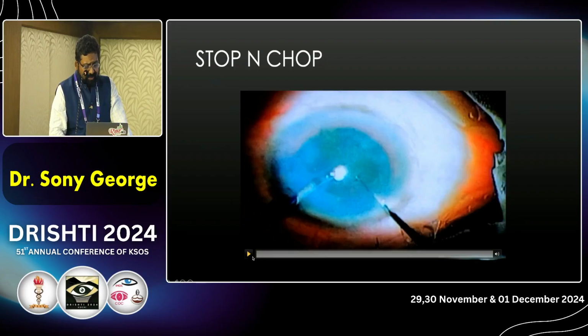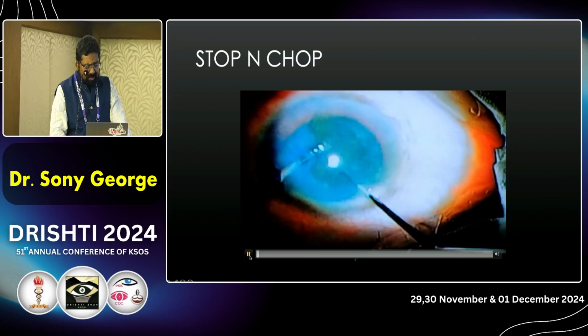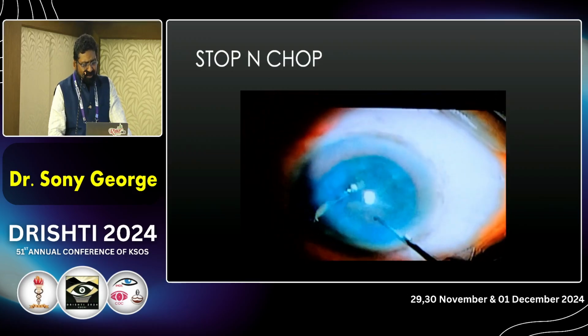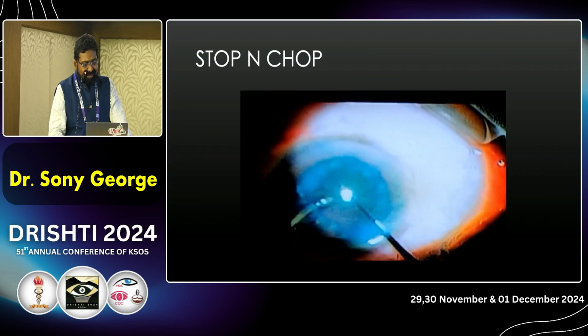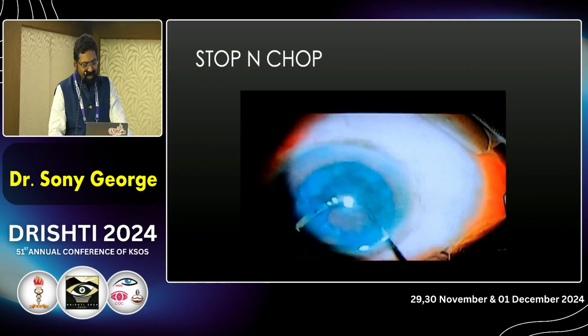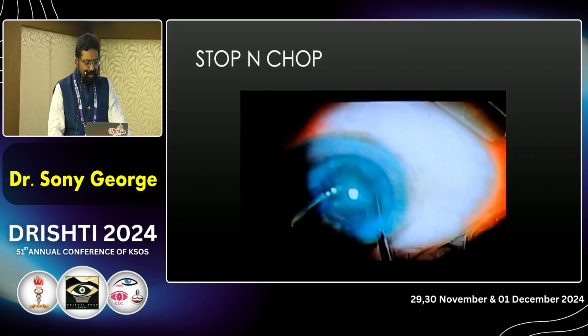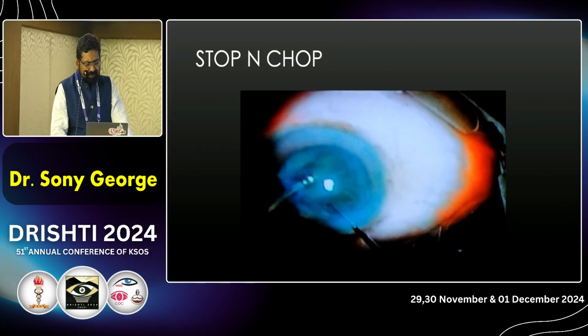And yeah, this is what happens. Although you are not chopping, small fragments are coming through, and you keep rotating. Instead of the whole nucleus coming, bits of nuclear fragments keep coming, and you can finish off the case with these.